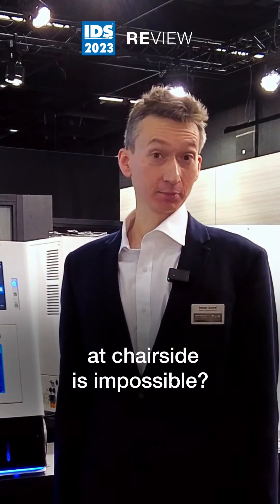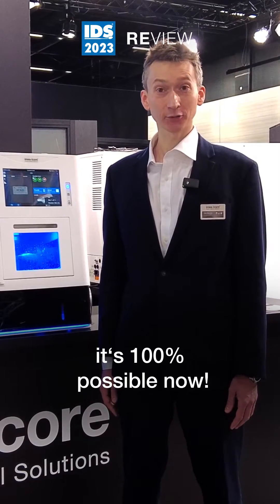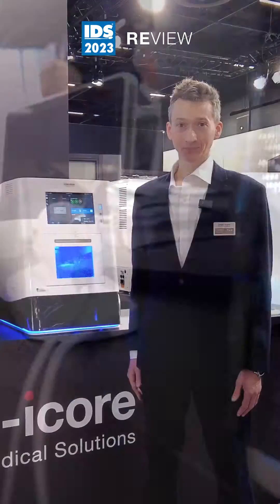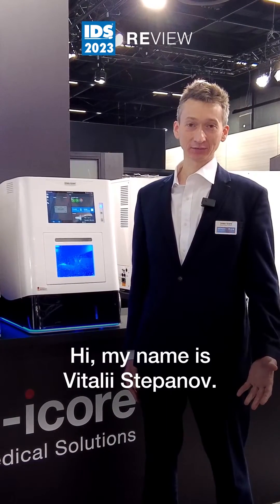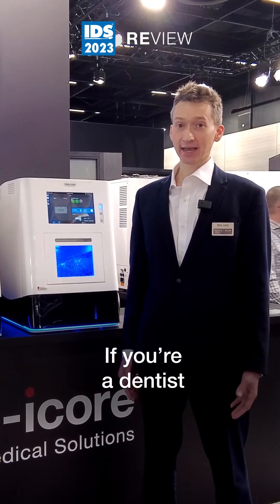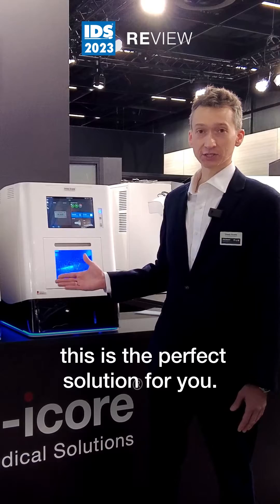Milling from the blank chair-side is impossible. Our answer to this is it's 100% possible now. Hi, my name is Vitaly Stepanov. I am a key account manager for imes-icore. If you're a dentist who is ready to go digital at your chair-side, this is the perfect solution for you.